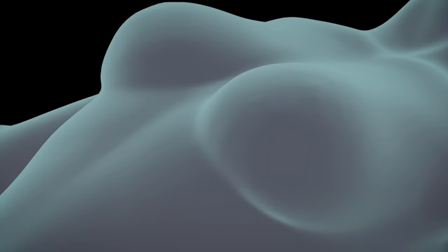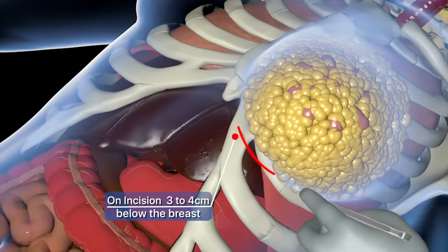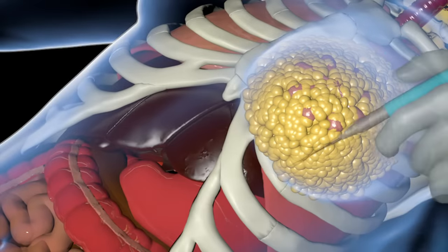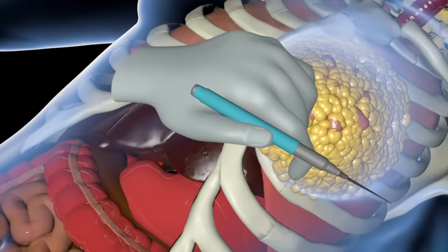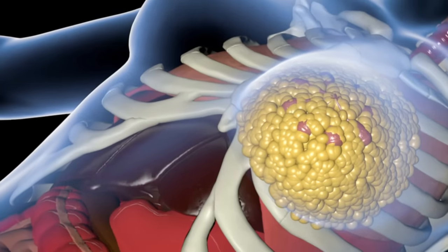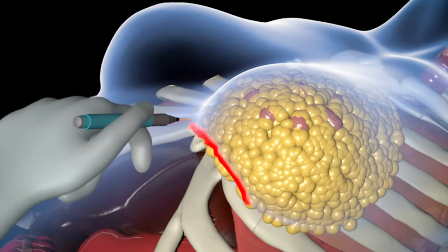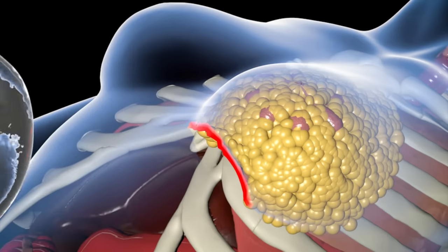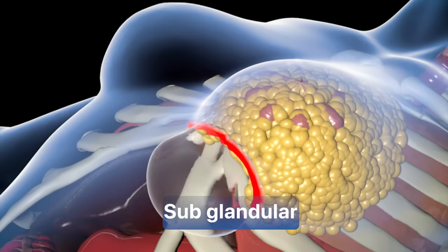Afterwards, following the previously made marks, the surgeon will make an incision three to four centimeters long, below the natural fold of the breast. Then the surgeon will use an electrocautery device, which is a medical instrument that applies heat and helps separate tissues to prevent bleeding. With the electrocautery device, the surgeon will separate the fat from the muscle to create a pocket-like space where the implant will be placed. This technique is known as sub-glandular.